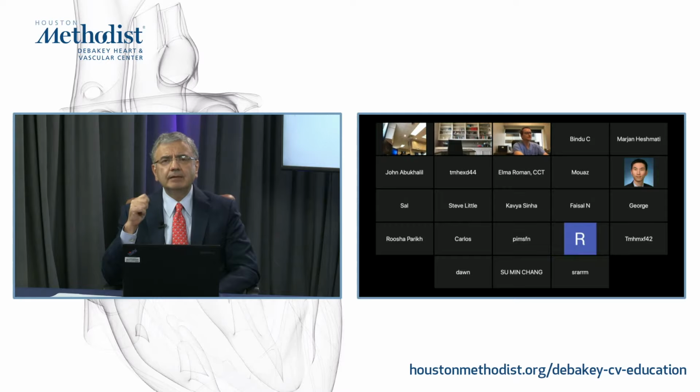Yes, I think most of the earlier contraindications have been taken away because of experience and large registry data. So we don't screen for PFOs anymore. Obviously, if the question is, number one, is there a PFO, yes or no, the second generation agents we talked about are not the indication.